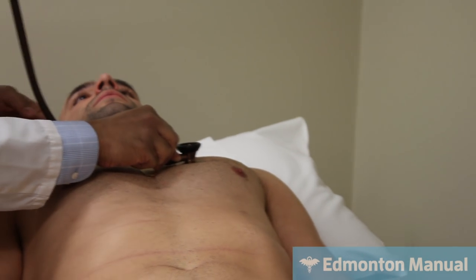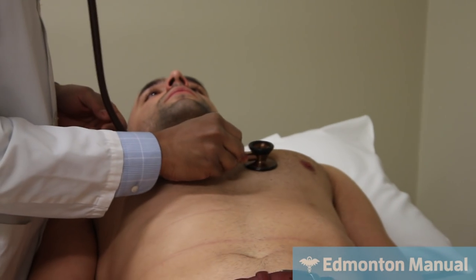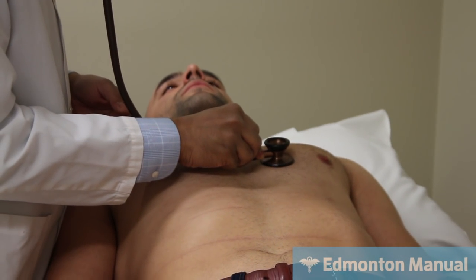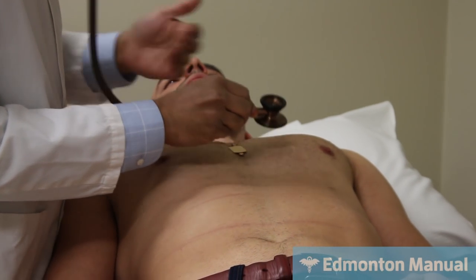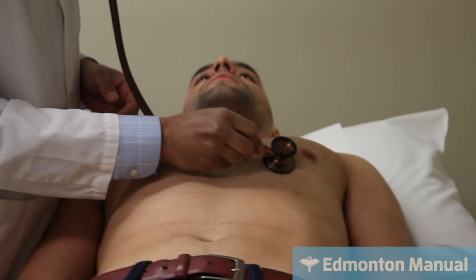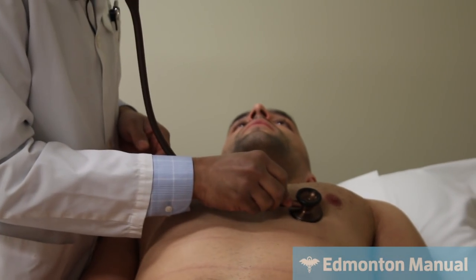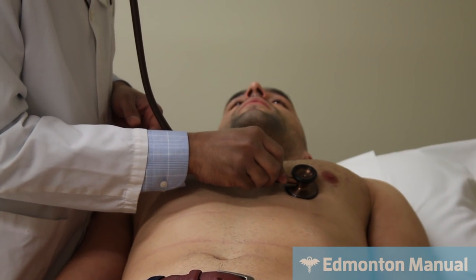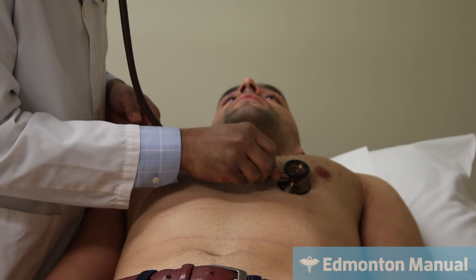Again, over the left upper sternal border. And the left lower sternal border. And then moving to the apex. And I ideally will go fifth intercostal midclavicular, wherever I felt the apex. So first I'm going to start again with the diaphragm type pressure. And I can hear S1 and S2.